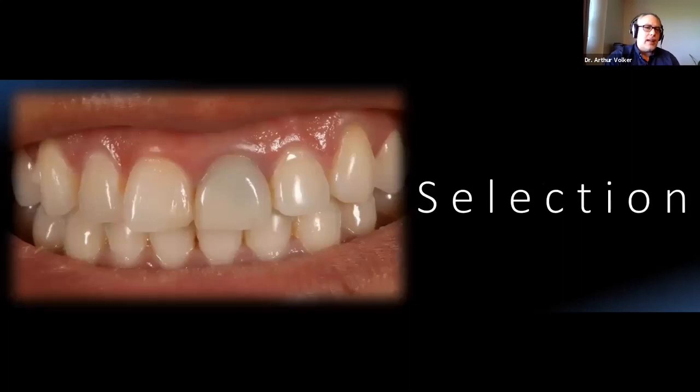This was a patient that came to our office, and first looking at this crown, actually the shade selection, I actually think was quite good. I don't think there was a problem with the shade, though we can see that there certainly is a problem in the mid-body to cervical of the restoration. And certainly this likely came from the selection of too translucent a material.